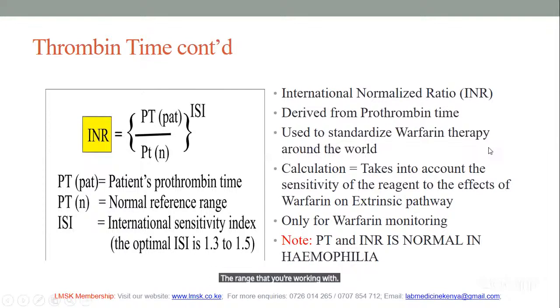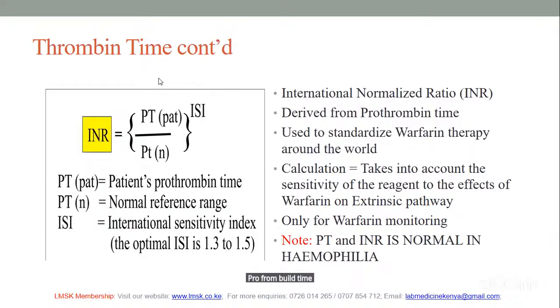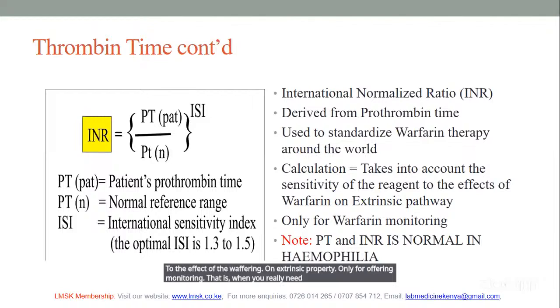So the international normalized ratio, which is the INR, is derived from prothrombin time and used to standardize warfarin therapy around the world. How to calculate this takes into account the sensitivity of the reagent to the effect of warfarin on the extrinsic pathway. It is only for warfarin monitoring, that is when you really need to do it.